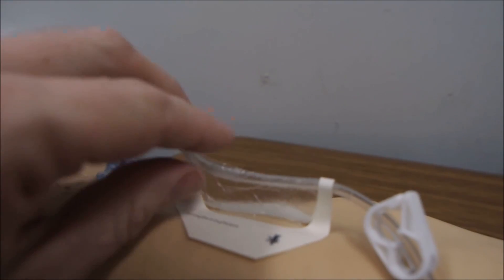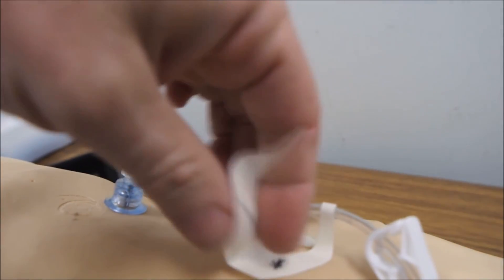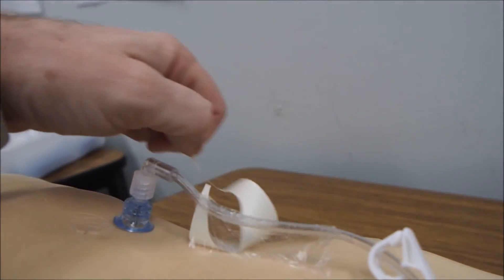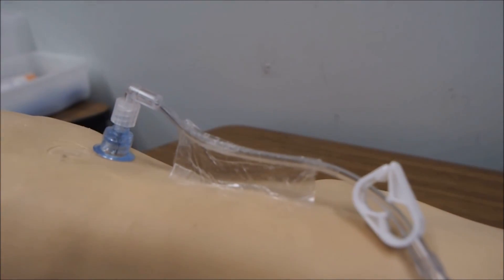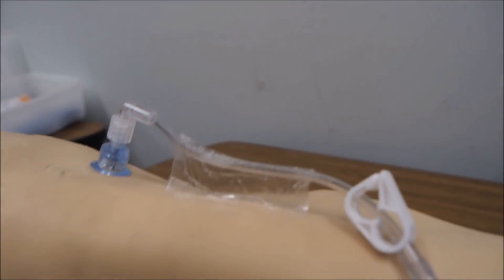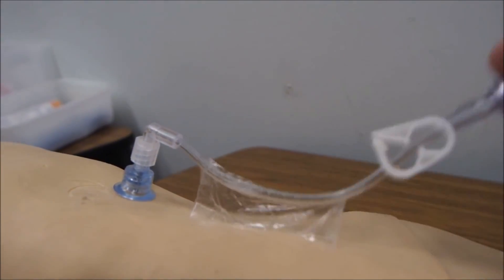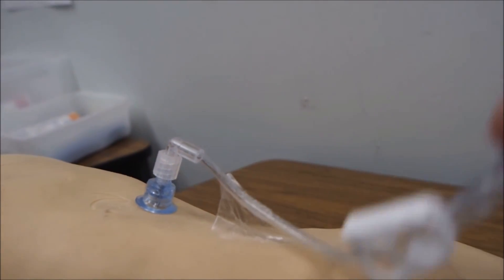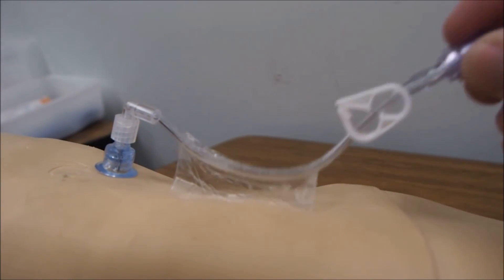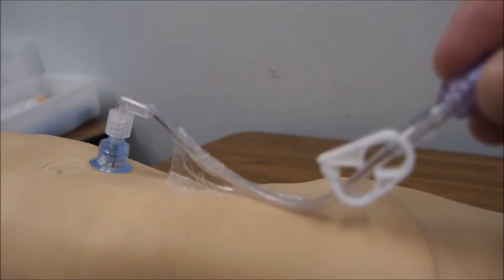The best technique I've found for securing the tubing is to use a Tegaderm folded over itself. That gives you a nice bridge between the tubing and the patient. The fact that it's not actually connected to the patient means there's a little bit of give, a little bit of play. So if the tubing moves for whatever reason, it's picked up by that Tegaderm and not translated through to any pressure on the IO itself. Importantly, there's no vertical pressure pulling the IO directly out.